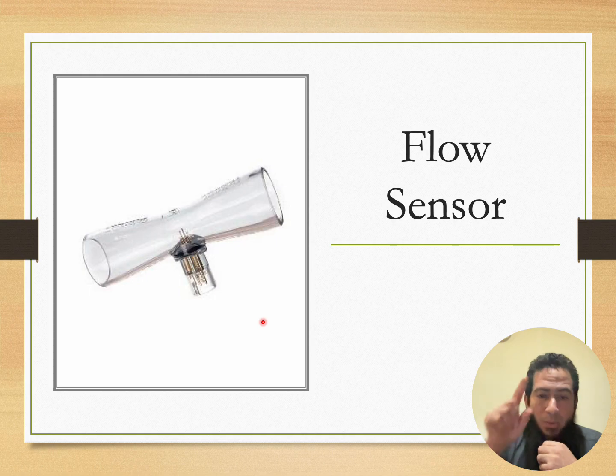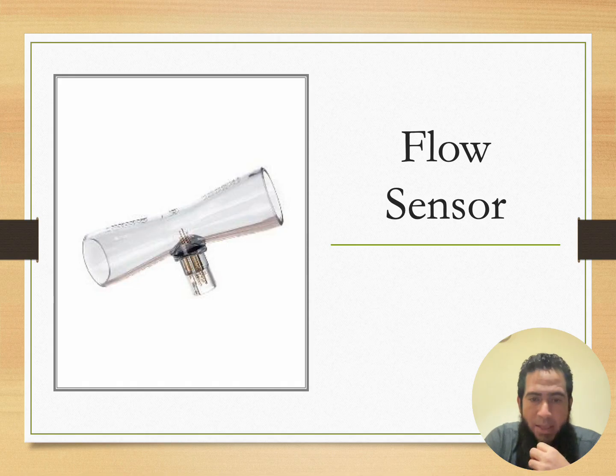By the way, we drew the flow wave as a square, but actually it's not necessary to be a square at all. Different types of flow modes can be adjusted in the machine, as we will see in the real ventilator in the next picture.